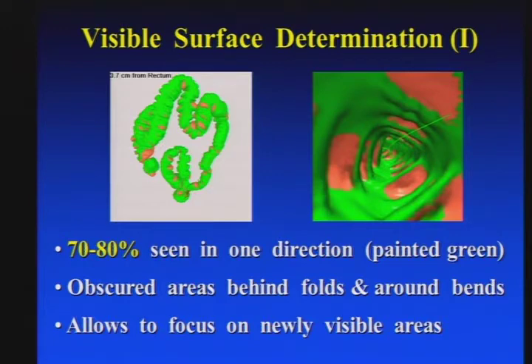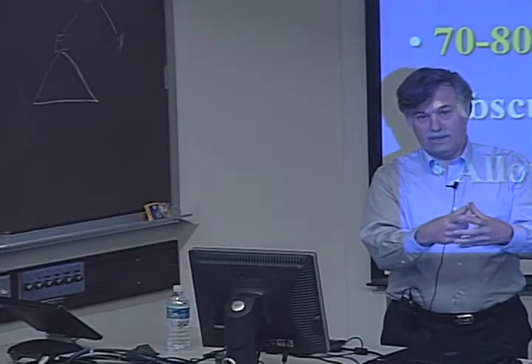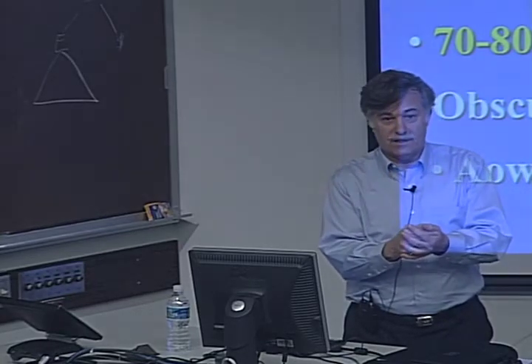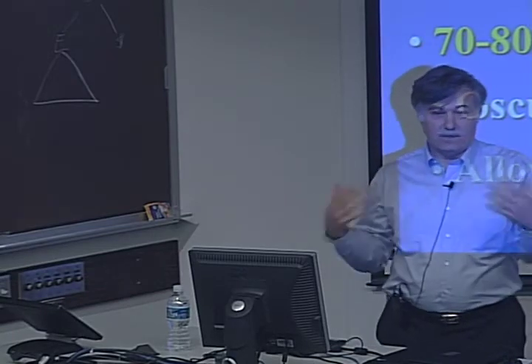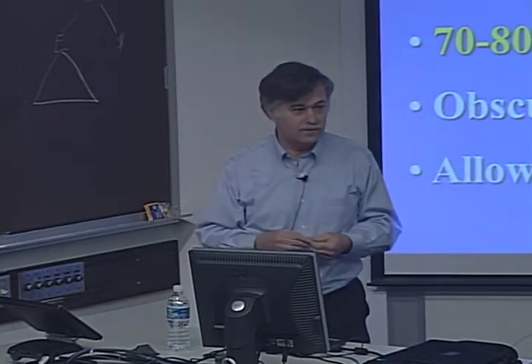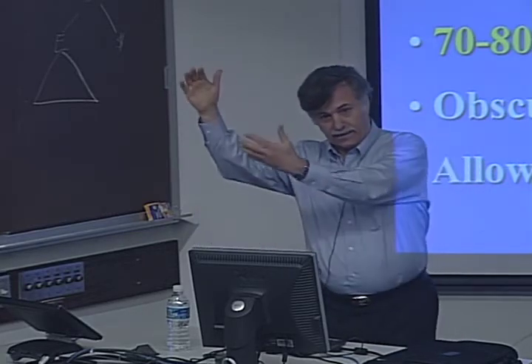I mentioned before that in optical colonoscopy, yes? The color came from the shape analysis? No, the color came from integration along the ray for volume rendering into the polyp. So what we're doing is basically volume rendering with a translucent transfer function. And the mapping to red, green, and blue is an arbitrary mapping that we did. So these are artificial colors, of course, but we have a certain scale. Red is a high density, green and blue are lower.